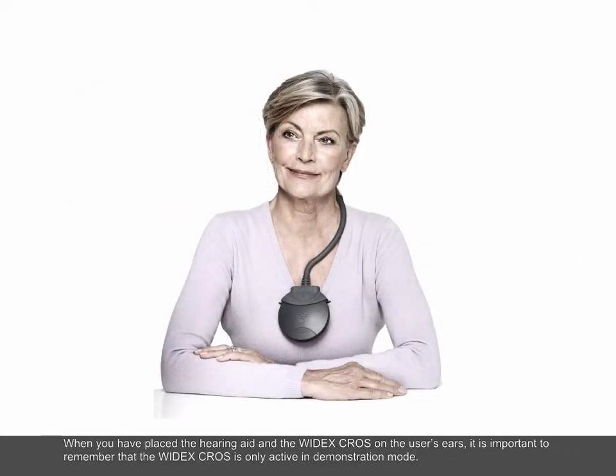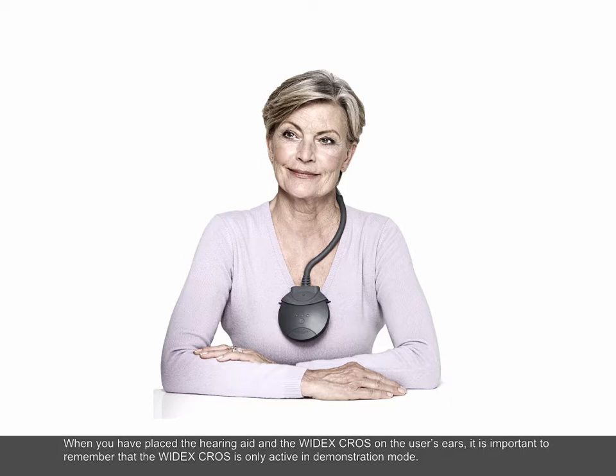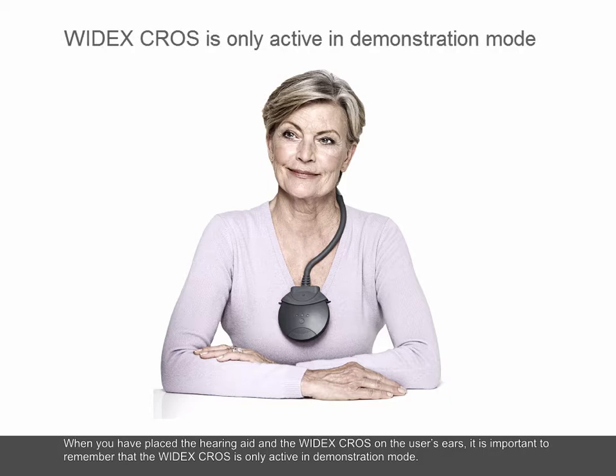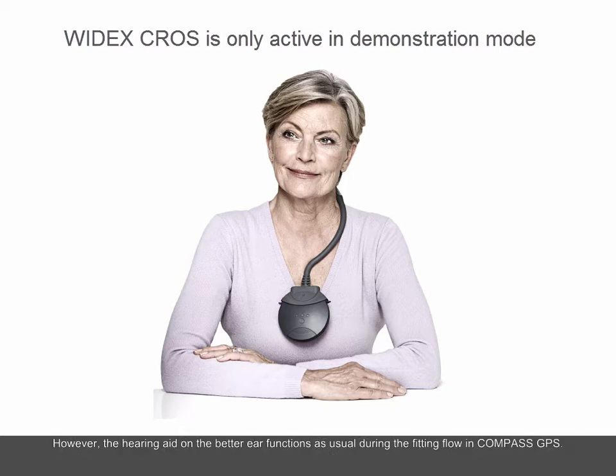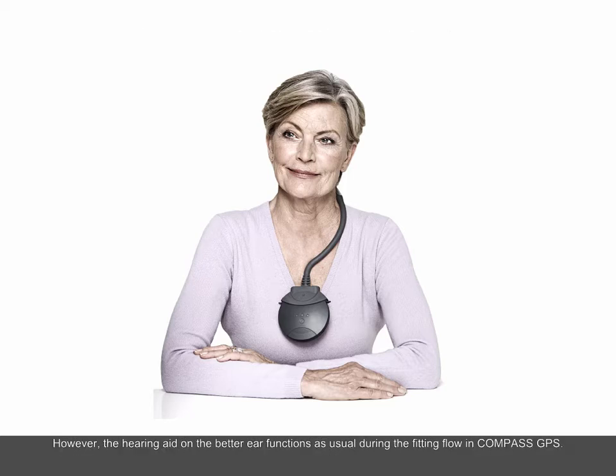When you have placed the hearing aid and the Widex CROS on the user's ears, it is important to remember that the Widex CROS is only active in demonstration mode. However, the hearing aid on the better ear functions as usual during the fitting flow in Compass GPS.